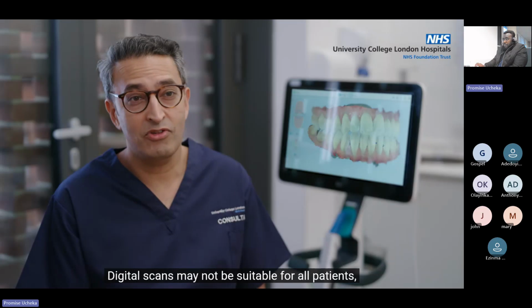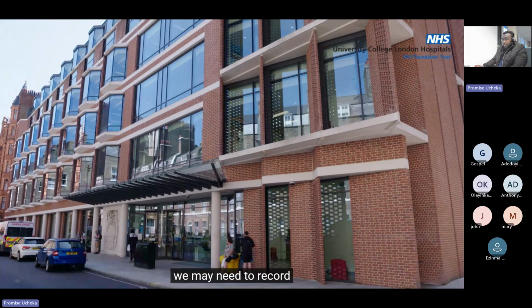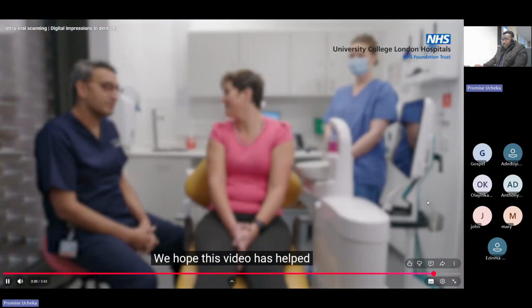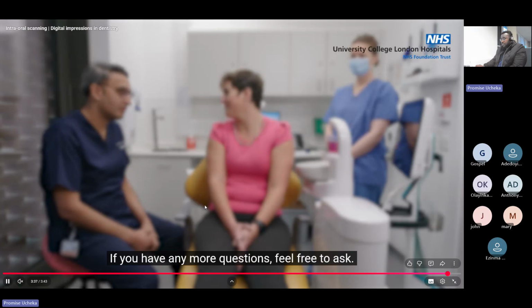Digital scans may not be suitable for all patients, and in certain forms of treatment we may need to record conventional impressions, but digital scanning would be our preferred option where possible. We hope this video has helped you understand the benefits and process of intraoral scanning at UCLH.